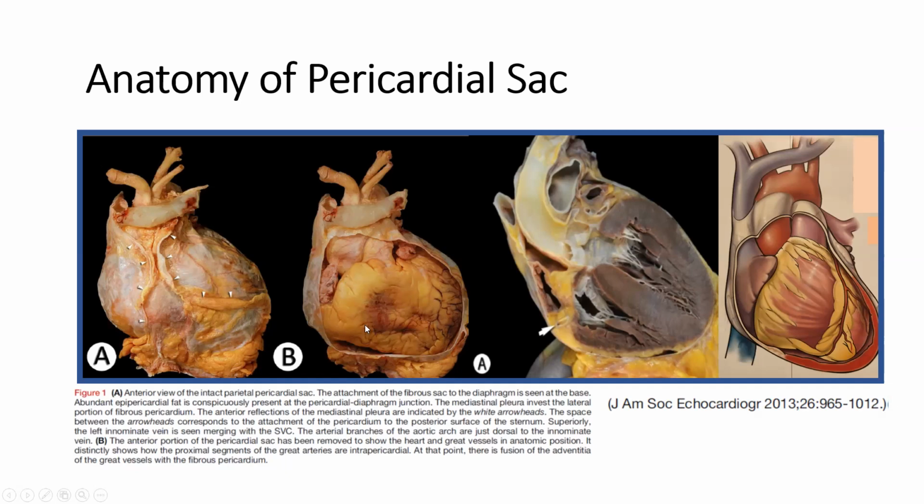One of the clues is pericardial effusion. We also know that very proximal aortic dissection can rupture into the pericardial sac. It is because the root is within the pericardial sac. And also these two small structures seen anteriorly are the atrial appendages. So left atrial appendage, right atrial appendage, they do have a pericardial space outside them.